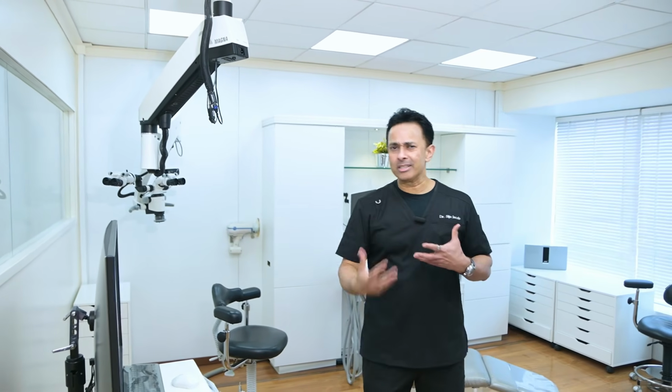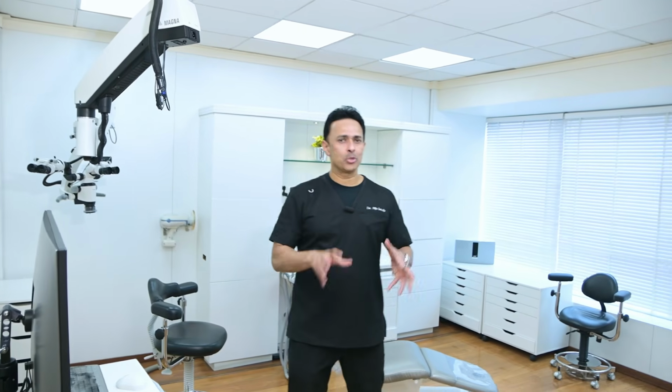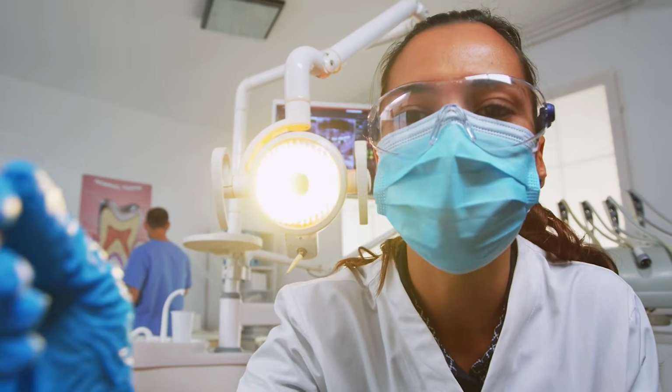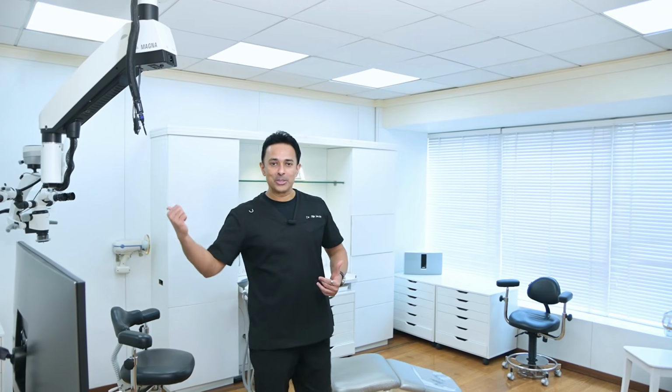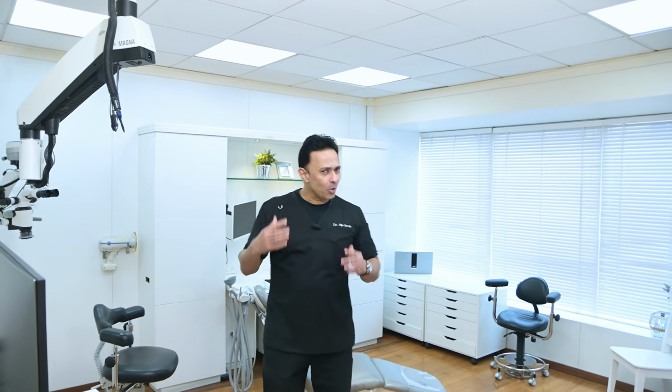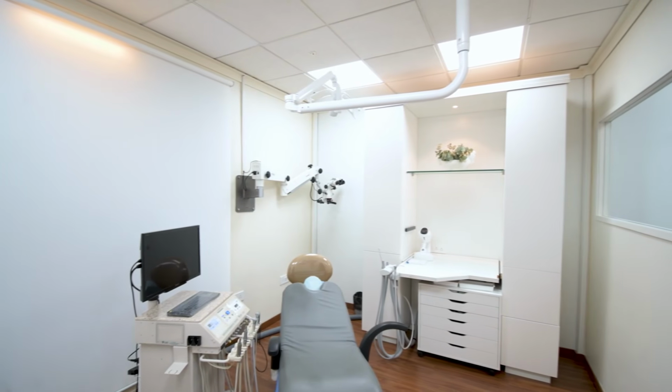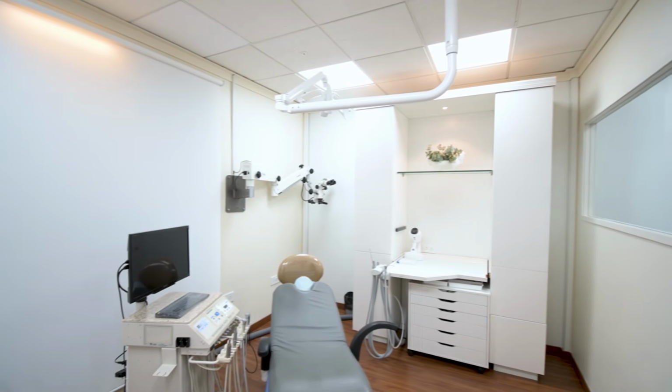And what are the typical arms which are there in most operatories? One is the chair light. So you find that we don't have a chair light because we do everything through the surgical microscope. If at all you have a chair light, then you want to make sure that it's not clashing with the microscope arm. So that's point number one.